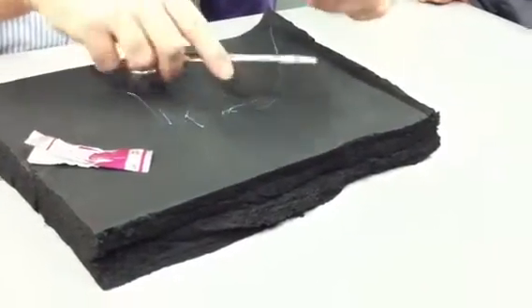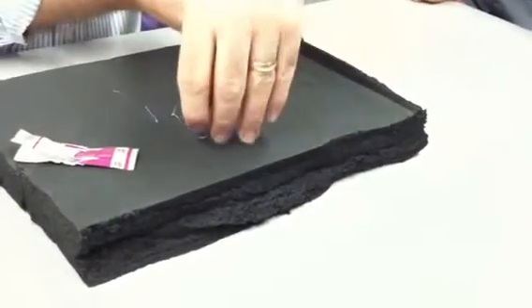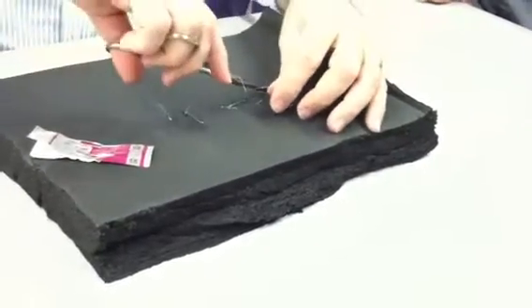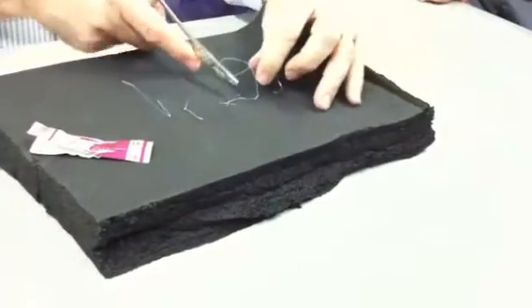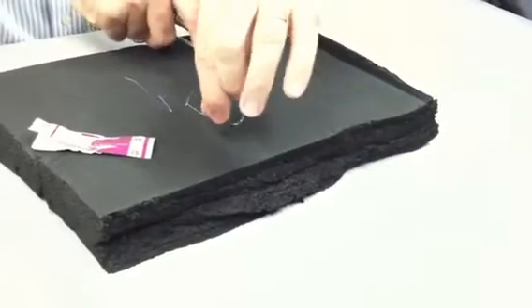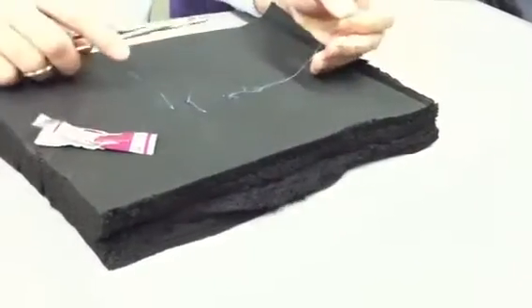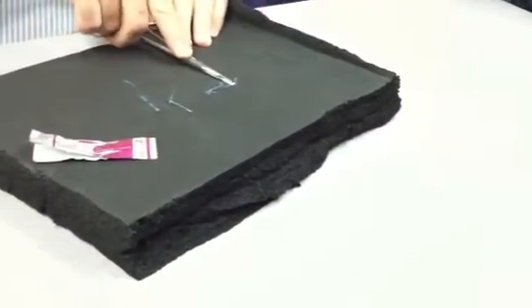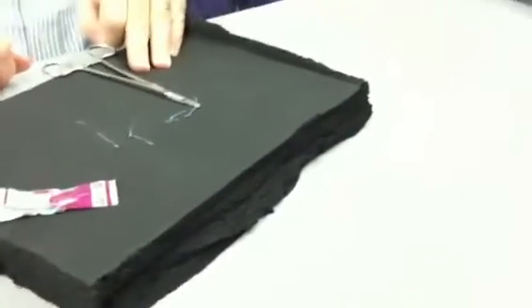So inside the V, two throws, grab the tip. The knot wants to lay horizontal like that, so I'm going to cross my hands. It's a little uncomfortable, especially on that first knot. This knot right here is when it gets a little bit more comfortable because you're crossing at the wrists. Otherwise the knots are the same. And if I was worried about tension, I'd put some kind of stent under there to prevent it from coming through.